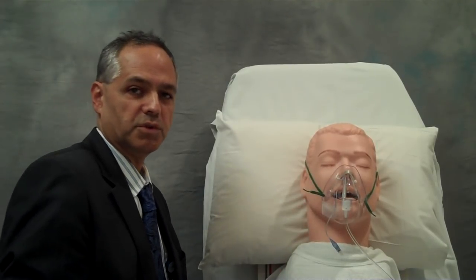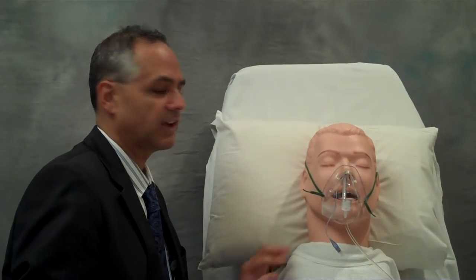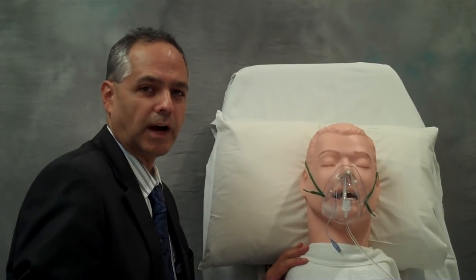This provides a very comfortable way to mechanically ventilate and oxygenate our awake patient.